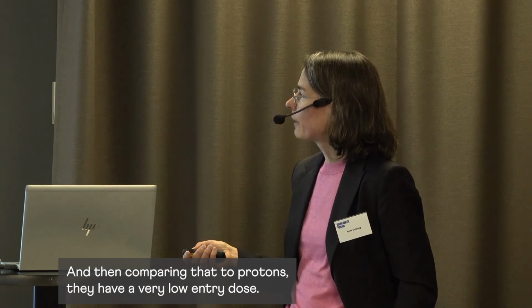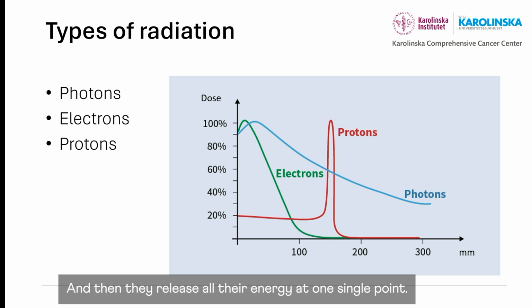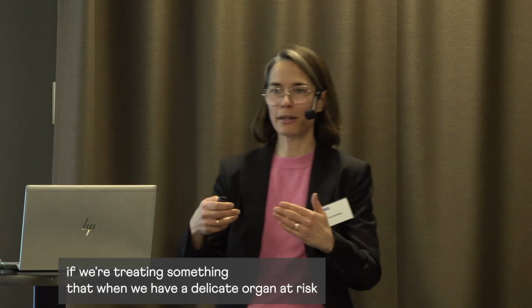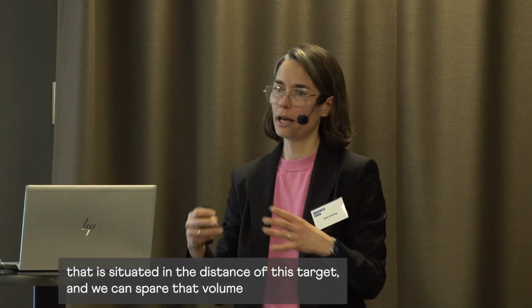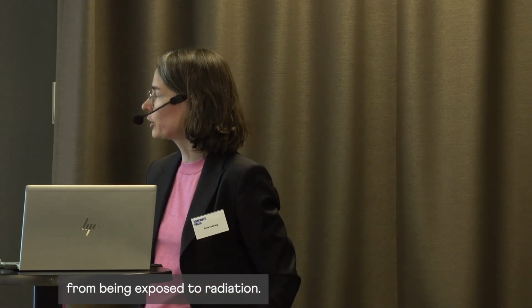And then comparing that to protons, they have a very low entry dose, and then they release all their energy at one single point, and after that is nothing. This can be very useful if we're treating something where we have a delicate organ at risk that is situated in the distance of this target, and we could spare that volume from being exposed to radiation.